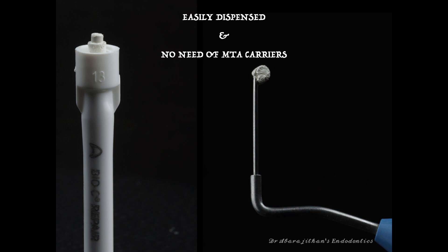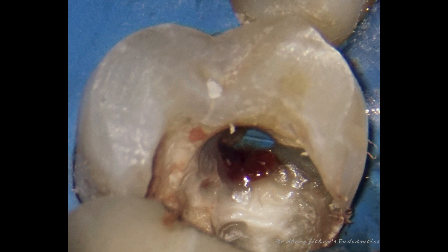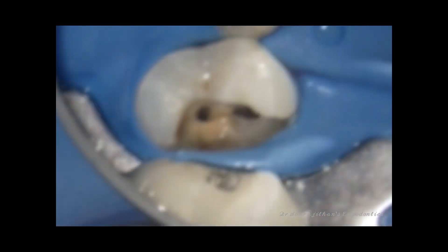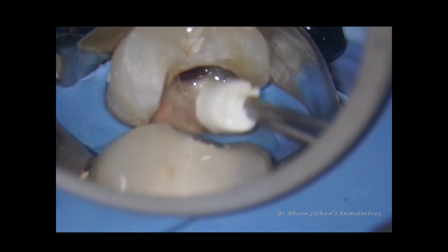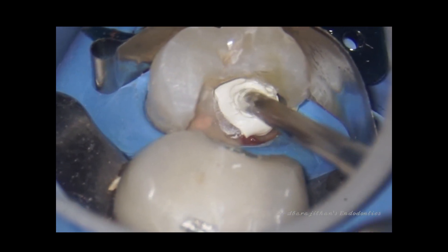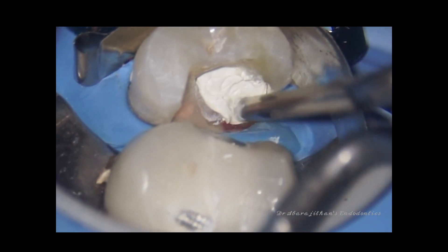The first case where I used this material is a perforation repair. This particular premolar was referred to me because the clinician was only able to locate one canal and created an iatrogenic perforation while searching for the second canal. After we managed to locate the missed canal, we proceeded to repair the perforation. You can see here it's very easy to dispense — it's not sticking to my instrument. I'm using my Buchanan plugger to pick up the putty from the syringe and place it into the cavity.